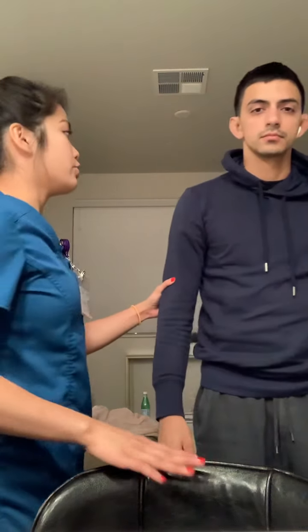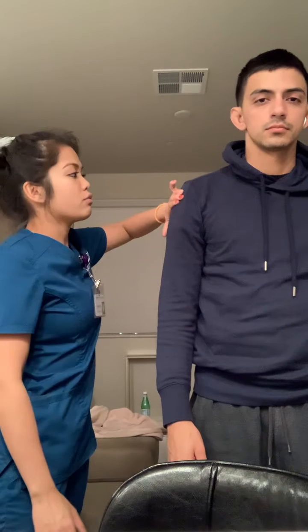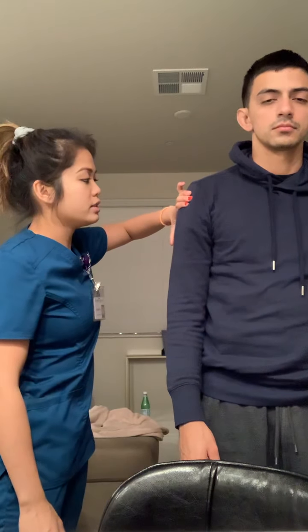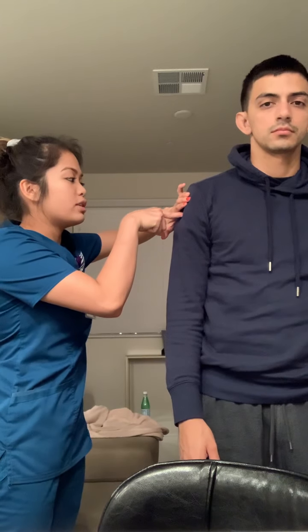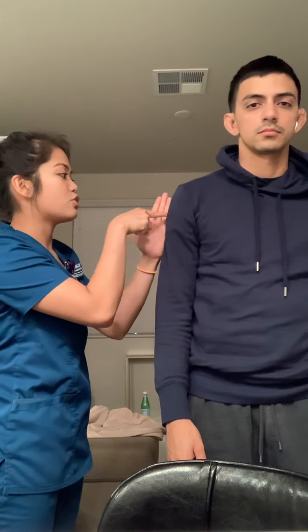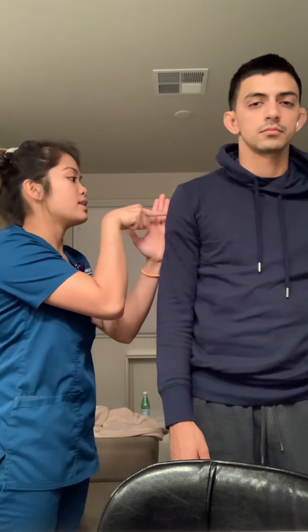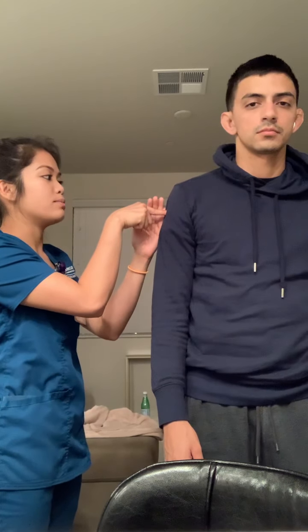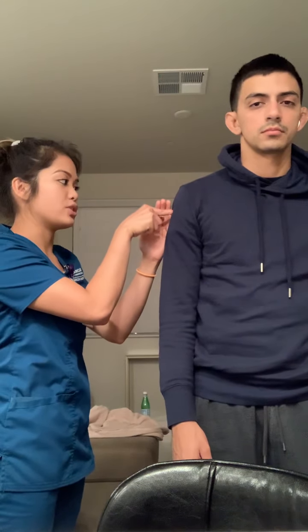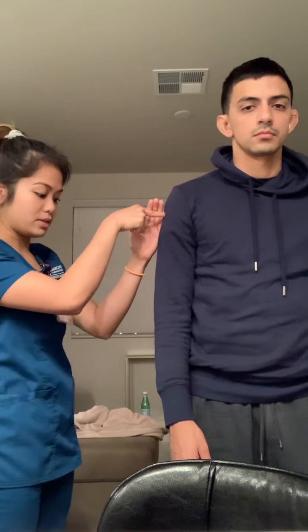All right, so for the deltoid muscle, you must first find the acromion process, which is right here. You're going to put 3 fingers below the acromion process, and so the injection site will be right here. Again, when you're administering the injection, you must use the Z-Track method by pulling the skin firm, and then injecting at a 90 degree angle, just like that. And then don't forget to aspirate before administering the medication. So you aspirate, and then you inject the medication into the muscle.